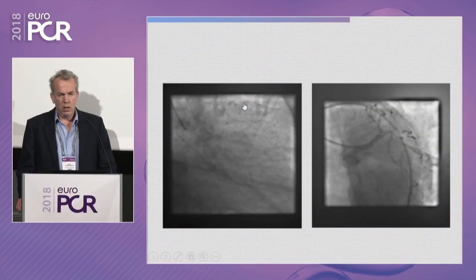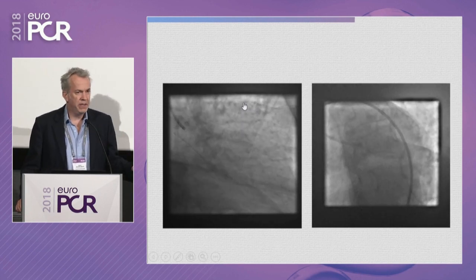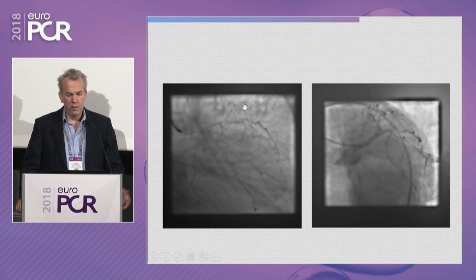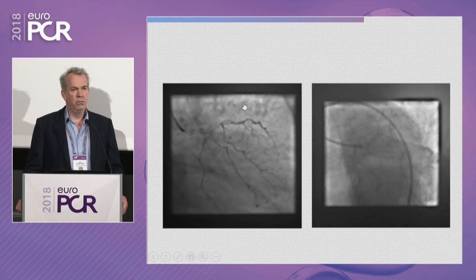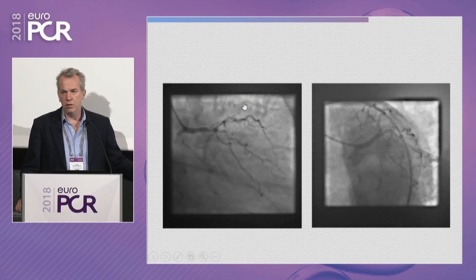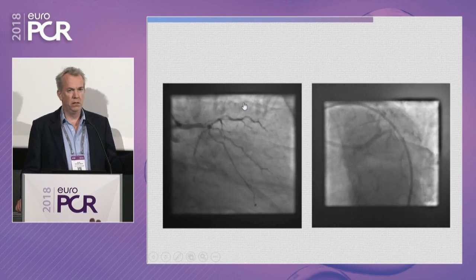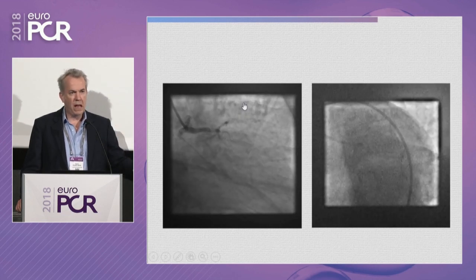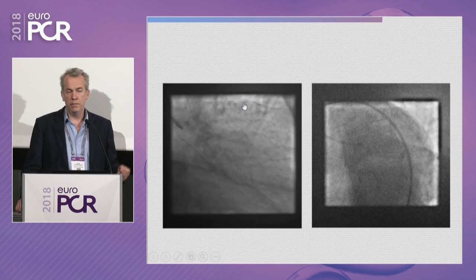Okay, well, let's open it up for a show of hands then. Who's going to stent it? He's got angina. He's limited. He's been admitted. But who's going to go for a provisional strategy, which is essentially starting with one stent, but prepared to use another stent if necessary? Okay, show of hands for provisional single. And a show of hands for planned dual stent strategy from the outset. Okay, so fewer people. Yes, a lot fewer people.